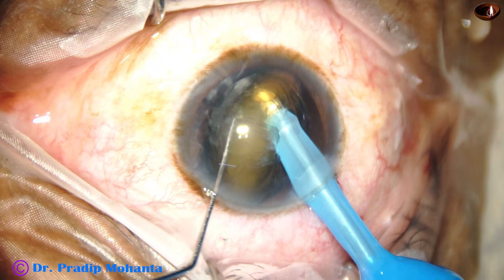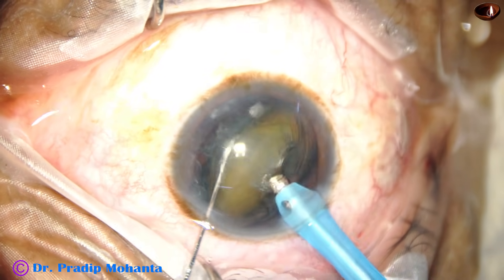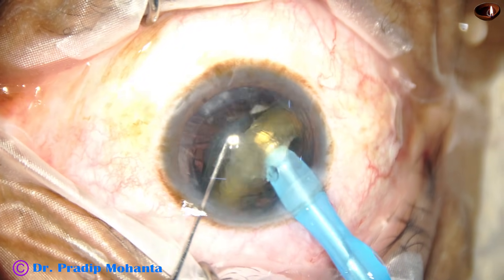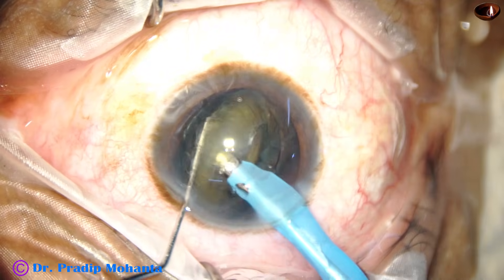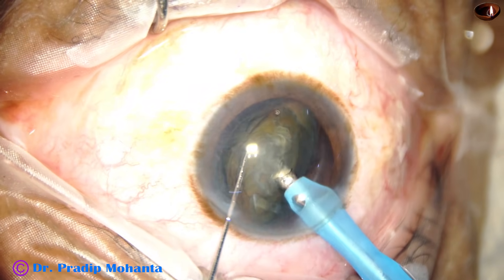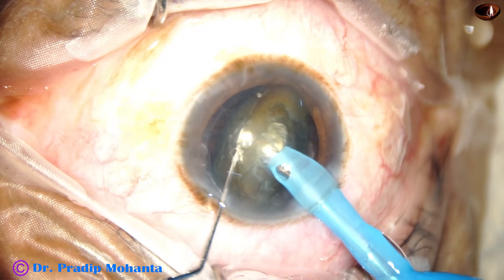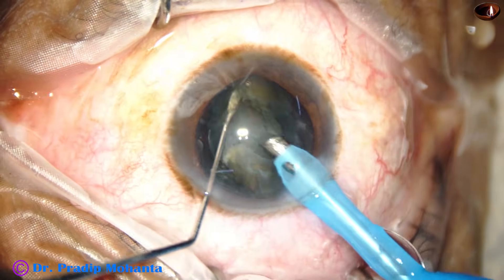Now this is one cut. This is an adjacent cut. This is another adjacent cut. Now sweep from one side to the other side — the supracapsular portion is detached and emulsified. Between these two instruments, crush this nucleus and start eating it up.